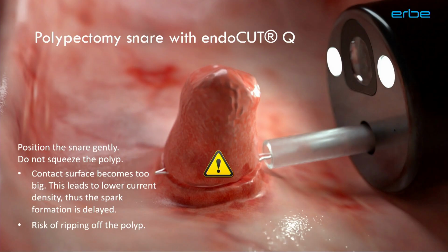Now, to do a good polypectomy, we advise not to squeeze the polyp, but just to have a gentle contact with the polyp. The less contact there is between the polyp and the snare, the gentler the contact, the higher the current density, the higher the current intensity, and the better the cut. A sharp cut makes the polypectomy better. If you have a lot of contact, there's a low current density, and the cut will become later, be delayed, or be more difficult. Also, it will generate heat. If you close the snare when it's generating heat without a real cut, you risk ripping up the polyp.